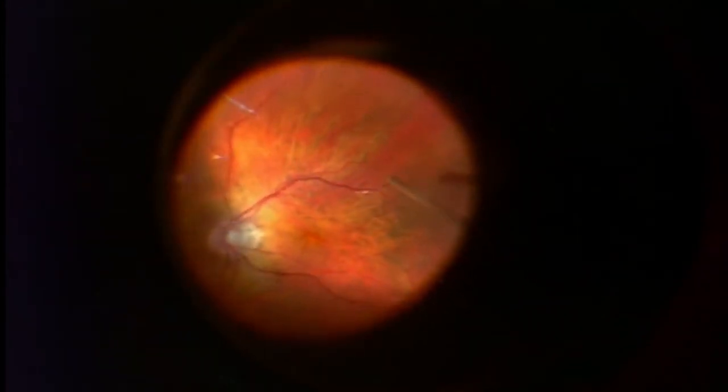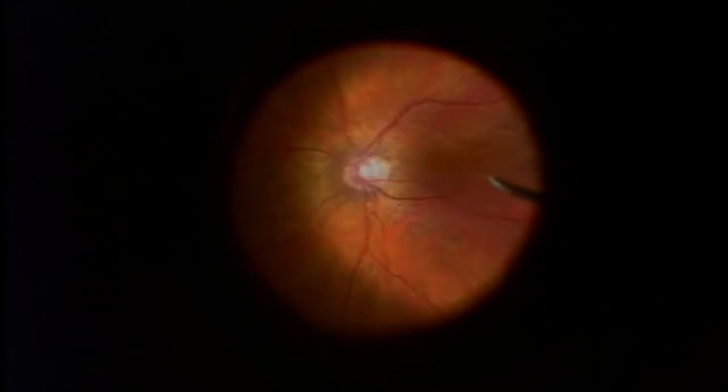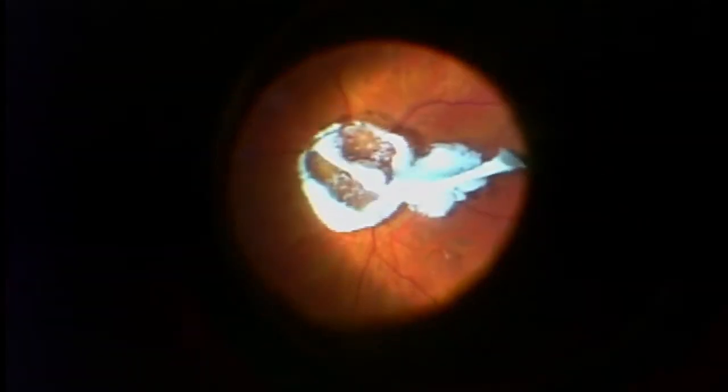The only reason that would be is if there is still vitreous adherent to the retina. I'm going to clean up the vitreous a little bit more and finish my so-called core vitrectomy. Then I'm going to inject a little bit of Kenalog right here — same color, kind of a finer powder. You'll see that it's actually floating on the surface of the retina, which is a sign to me that there are still layers of vitreous adherent to the retina.